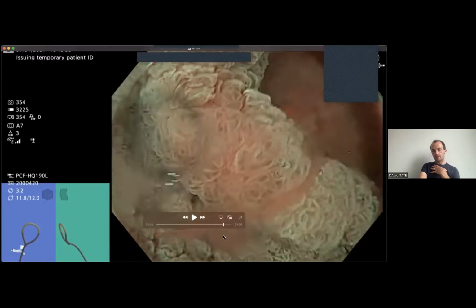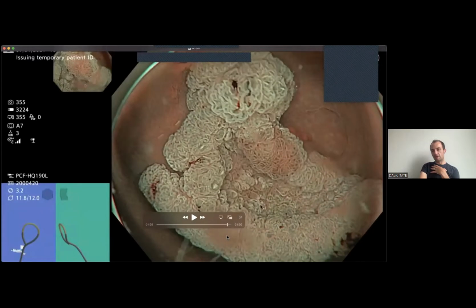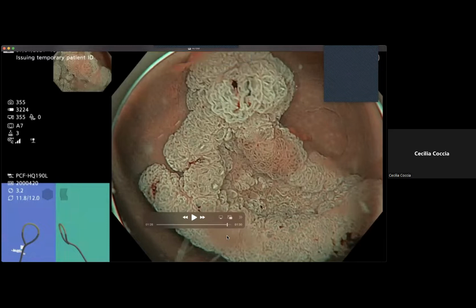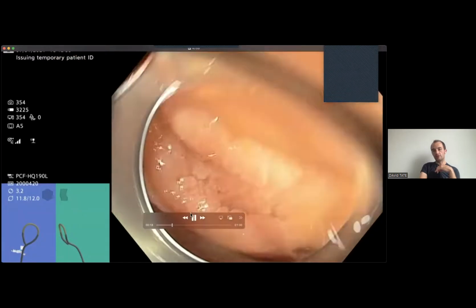Sometimes that can really help you. What about like that? That's probably the clearest view we've had of it, isn't it? And would you agree that it looks pretty regular? Yeah. Okay, so therefore, we don't have a demarcated area for cancer. So we then need to think about the other four things which might determine the risk of this polyp having cancer. So what were those? Can you remember?